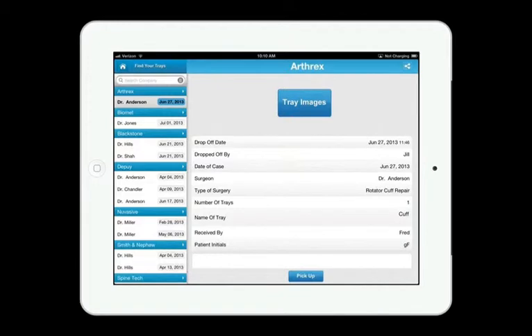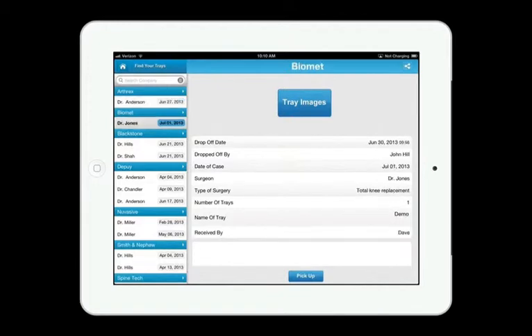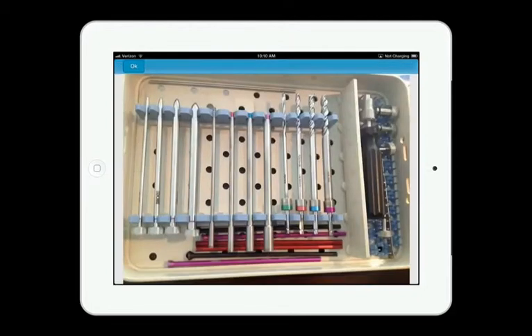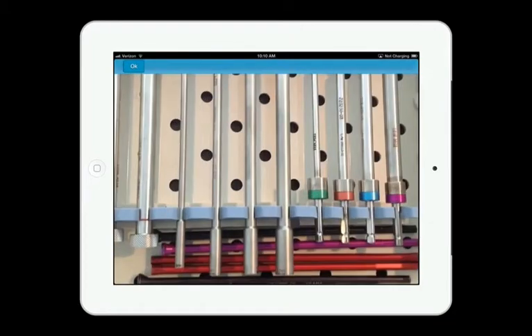He's going to find his trays on the left and select them. Now if the vendor thinks he might be missing an instrument, you can press the Tray Images button and take a look at the pictures that were taken when the instruments were dropped off. You can pinch and zoom and really look into the tray and determine if the instrument was in there when it was dropped off.